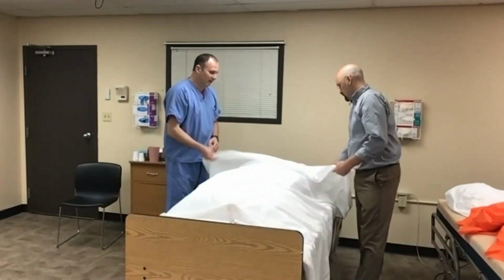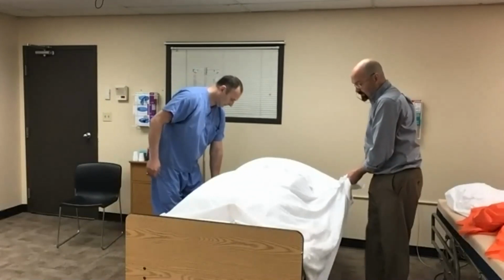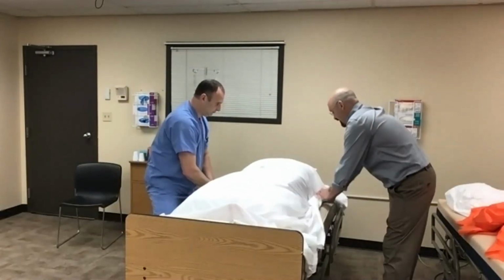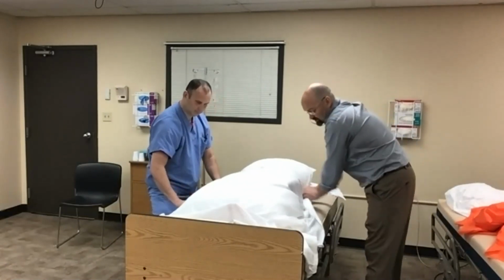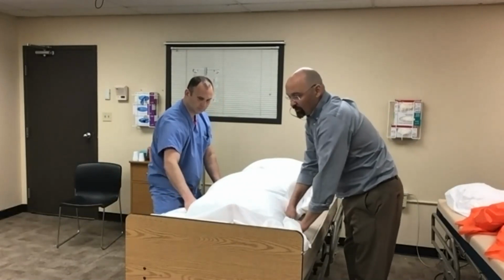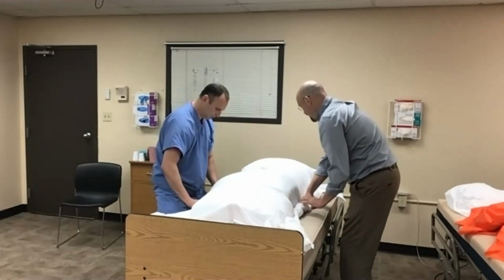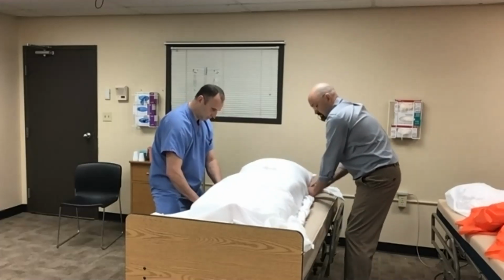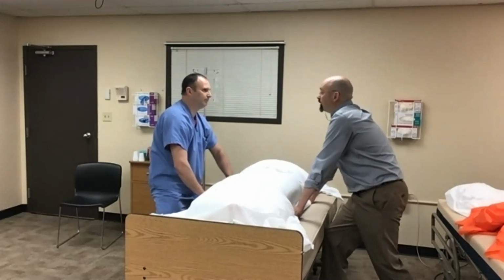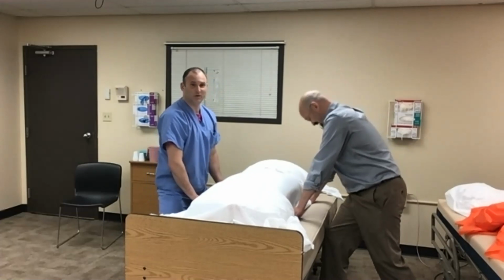Slide sheets are very inexpensive. Yes. Especially disposable ones. So same thing, we're going to put those pillows in place. We're going to burrito the patient. So if I have a patient of size, I'm going to want at least 8 or 9 people. You're going to want 4 people on either side plus 1 managing the airway. Rail? There's not enough space when you have more people, so no rail this time.